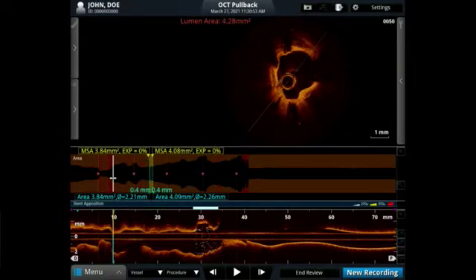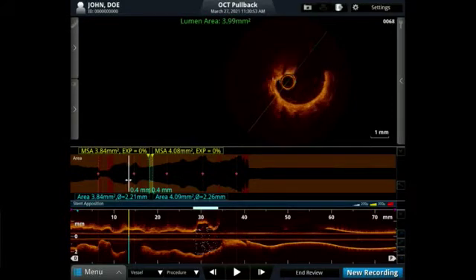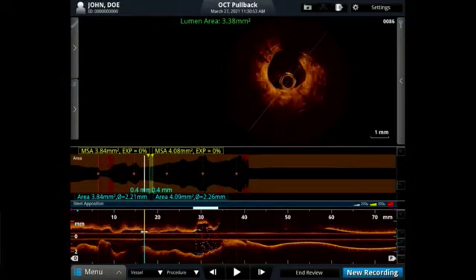I'm going to get through the stent now to talk a little bit about ISR. This is all neoatherosclerosis, as expected from a stent that was implanted in 2009. You can definitely see that there's a lot of fibrous plaque forming. It loses the homogeneity of intimal hyperplasia and turns into something more heterogeneous. That could tell you there is lipid, there is fibrous. As we see here, there's a lipid core. There's a lot of fibrous plaque here. Moving down the stent.